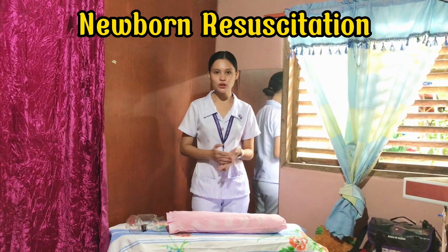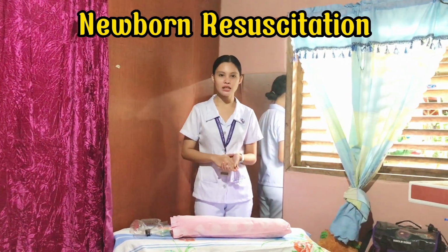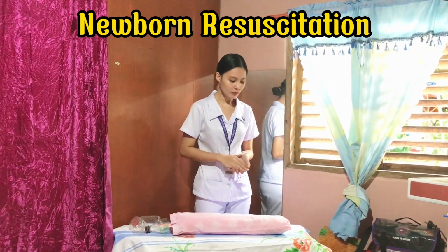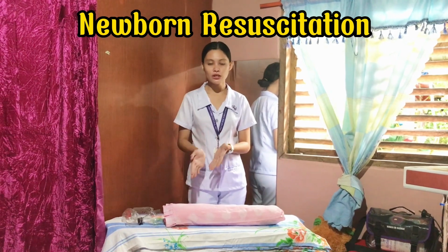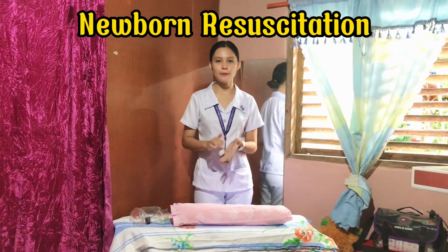So next we're going to open the airway, and we're going to do suction if necessary. So next we're going to do the positive pressure ventilation. So as for me, I'm going to use a bag mask.